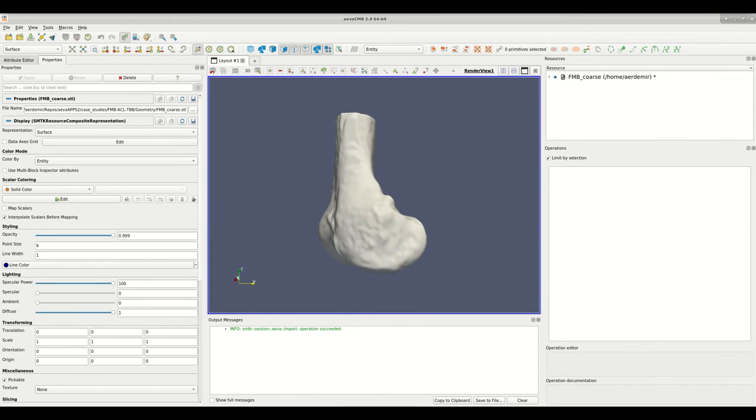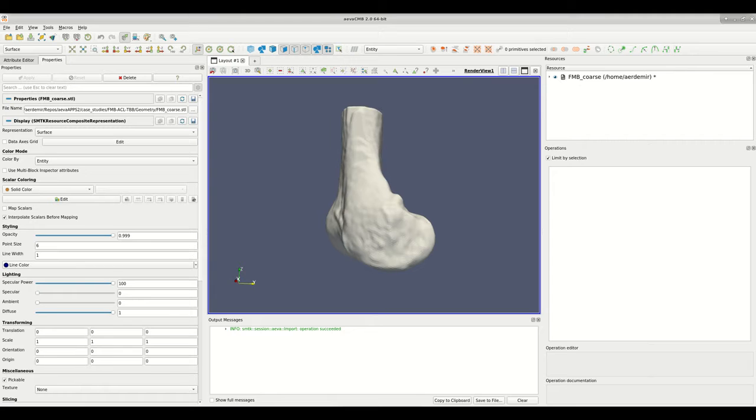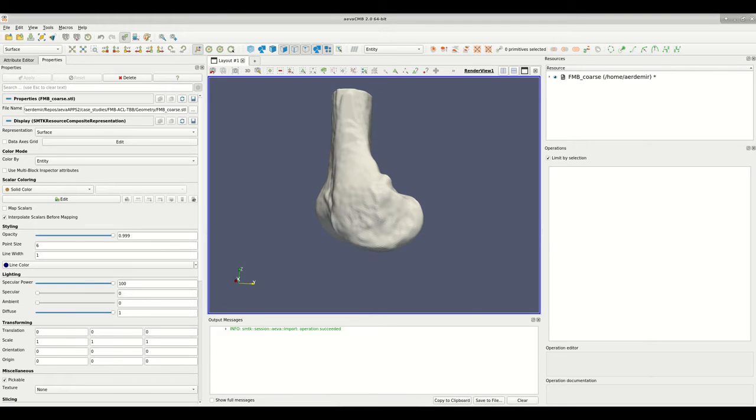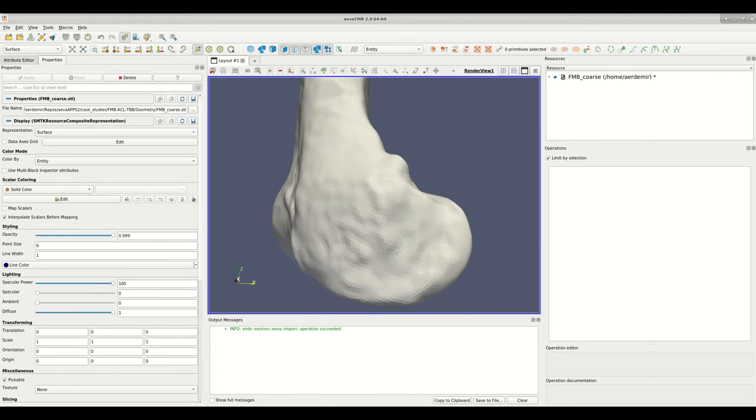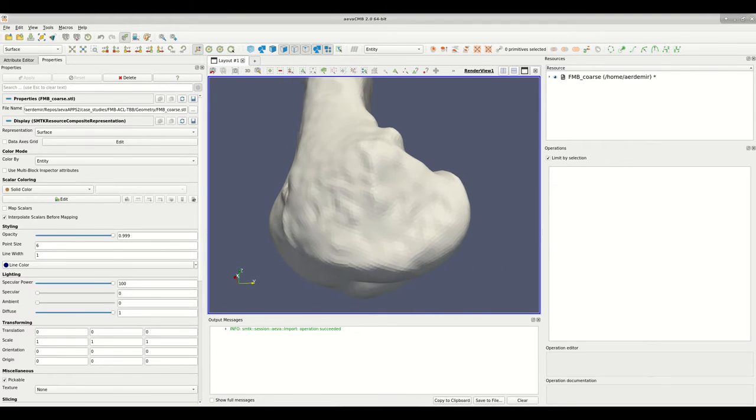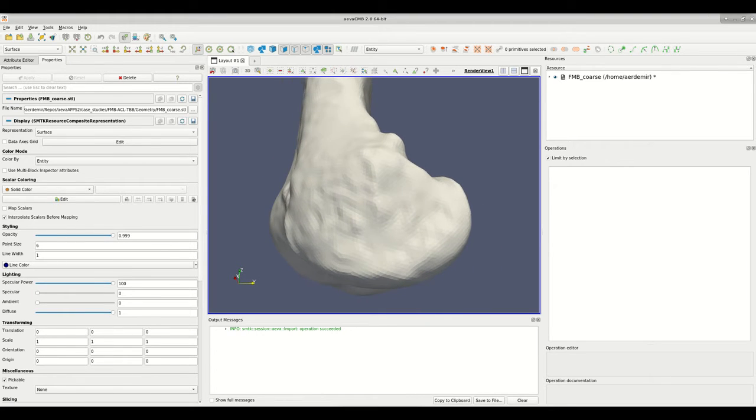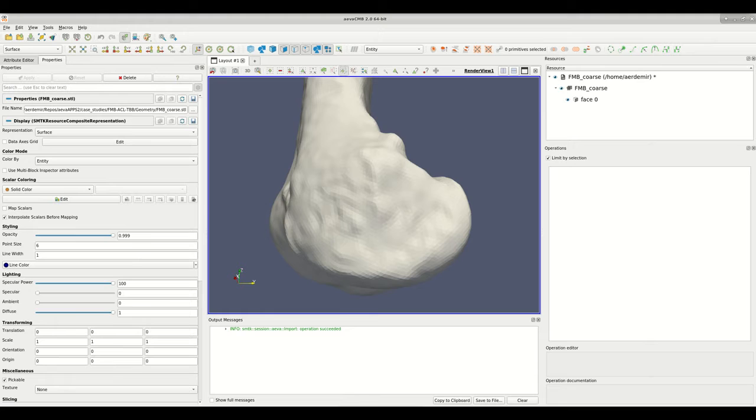In this video we will be demonstrating how to use the freehand region selection tool in AVA CMB. A surface representation of the femur bone is already loaded. This mesh-based representation of a femur bone is available in the download package as an STL file.